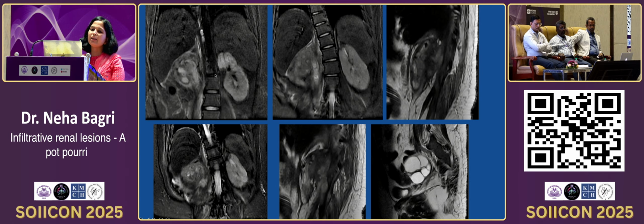Now this is an elderly female who came for MRI LS spine for low backache. So what do you see? The backache was due to the renal infection. She had a bad infection in her right kidney. The kidney is small and the calyceal system was distended with pus, and moreover there was a breach in the cortex and this collection was extending till the psoas. So always keep your eyes open. For any diagnostic modality, please look at all the organs which you can see, and she had an incidental cystadenoma in the ovary as well.